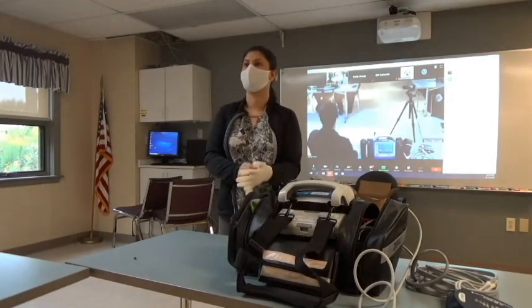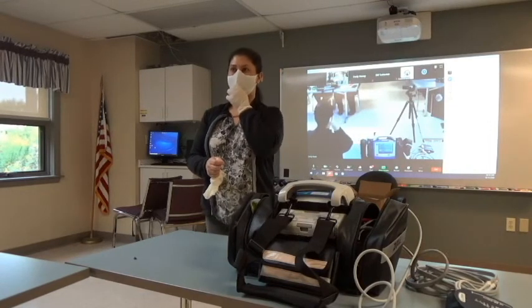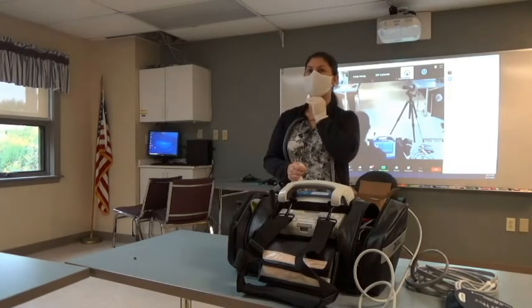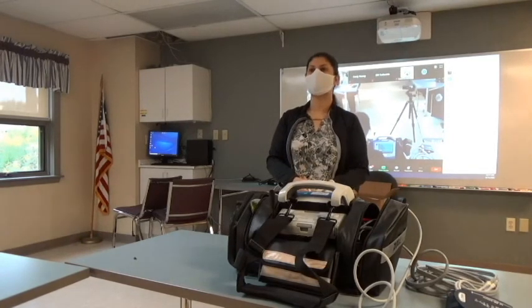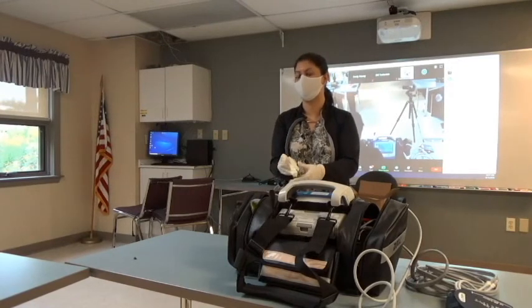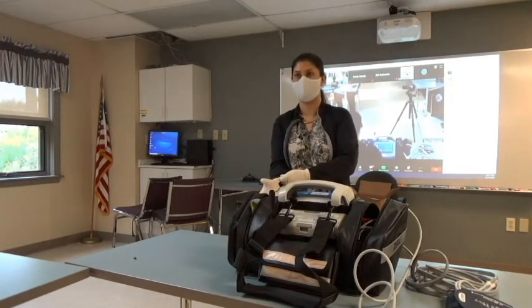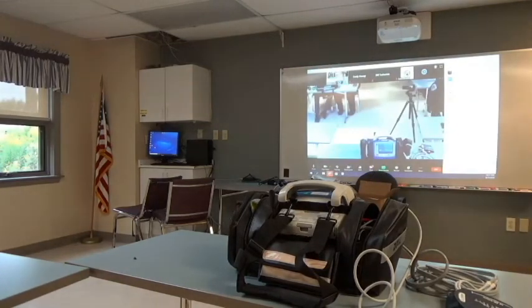Okay. So in the upload to EMS charts, does that transfer into add action automatically or just into the free text? I'm not sure. Something we'll have to pay attention to, guys. It might just be on the administration side to see those permissions get put through. How about clock sync? Who asked about that? I did. The clock sync is based off of the Wi-Fi. Okay. So when it connects to the time server, it should adjust.